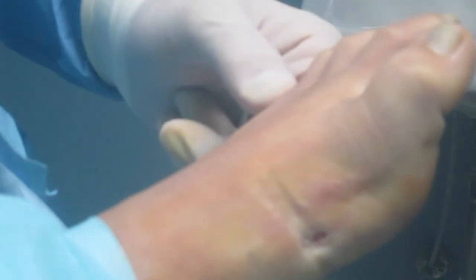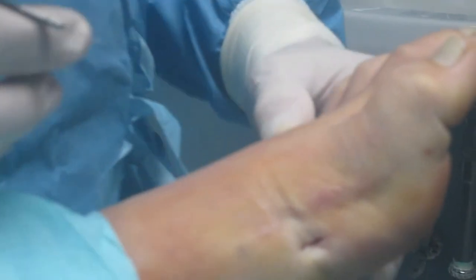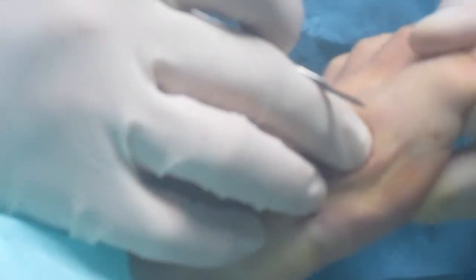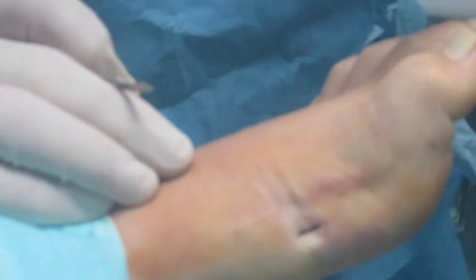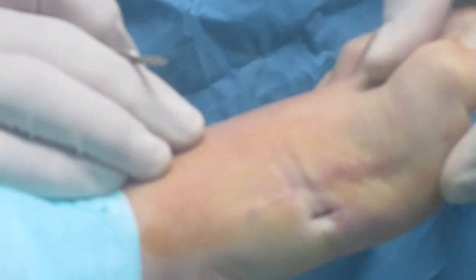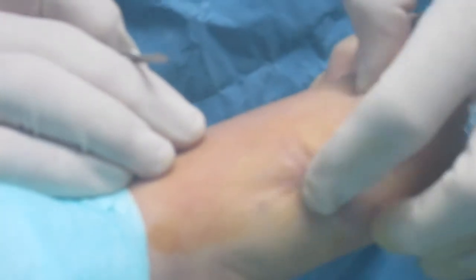See how that went? Just with that one soft tissue correction, you've got a lot of correction back lateral. Now another option is to go into your joint and release it here, but I try to avoid that because a lot of people with this type of problem actually have pain in the joint, so that's what brings them in. So I don't want to go back into that joint and alter that. I think this is a lot safer to do.